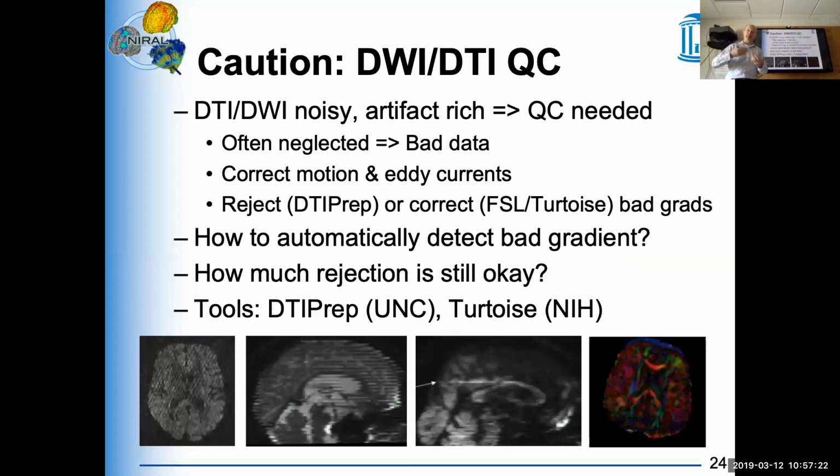So there was some resonance to the shaking of the patient bed, and it only happened at certain weights of the babies being imaged. So this was only being seen in certain studies. For a while, the Siemens Tim Trio had that issue and invalidated quite a number of our data sets. And when you have this data, there's no way to correct it. It's crap. You can just throw it away, unfortunately.